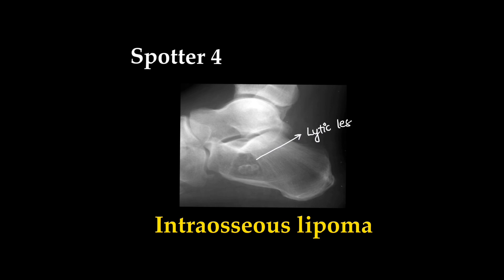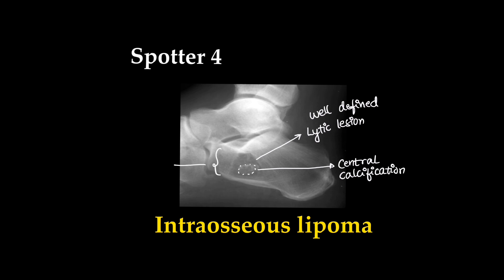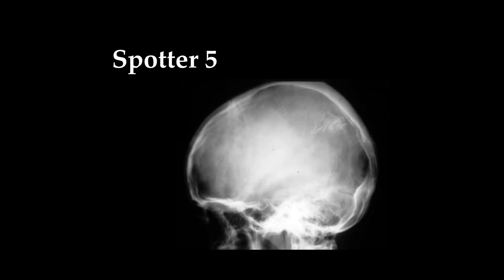This was a case of intraosseous lipoma. There is a well-defined lytic lesion which shows central calcification in the advanced stages, which gives the cocarde sign. The calcaneum is the most common site for intraosseous lipoma.